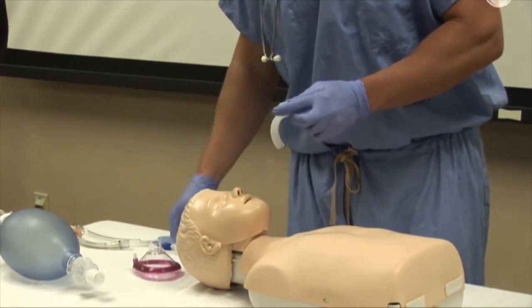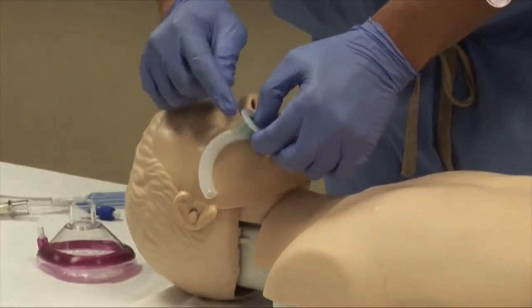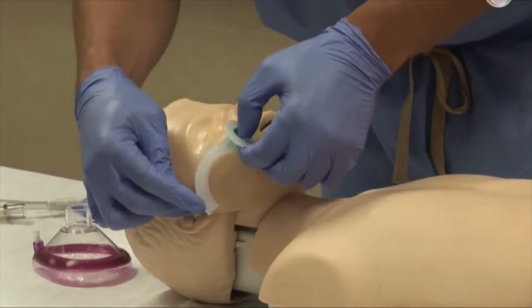Selection of a proper sized oropharyngeal airway is done by assessing the flange at the lips of the patient, and the tip of the airway should be at the angle of the jaw.